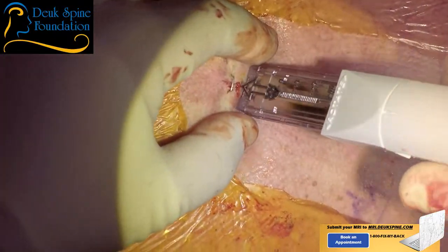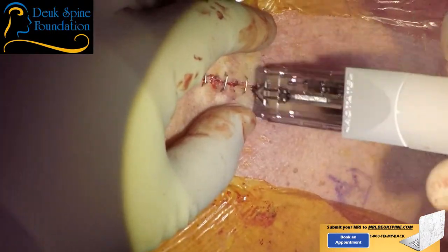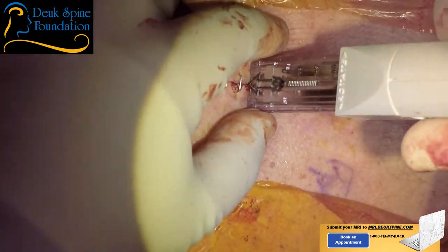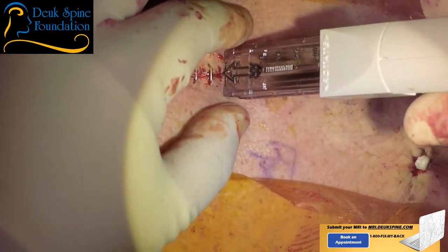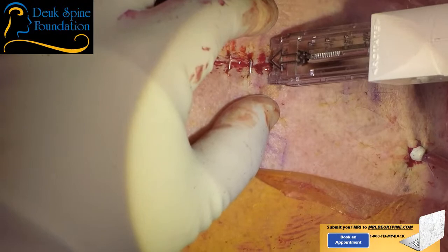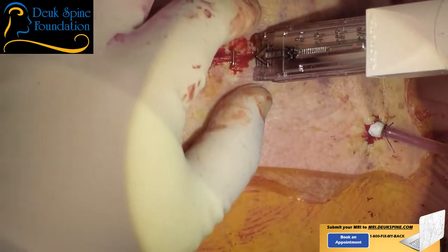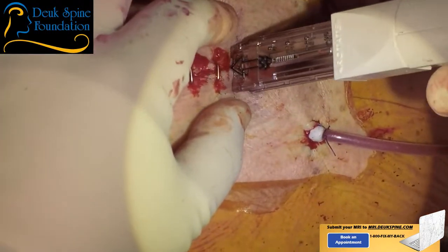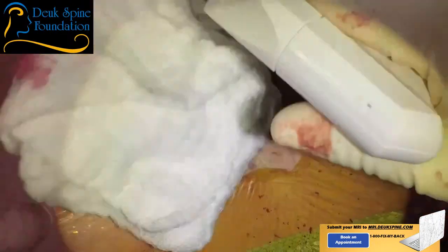So, I don't use Adsons. I just look at the incision carefully, and I pull the incision apart where it needs to be pulled apart, push it together where it needs to be pushed together. Some people put too many staples. How's our blood pressure? Remember, the staples aren't going to hold the incision together. Is the drain sucking? Because we're getting a lot of juice coming out.